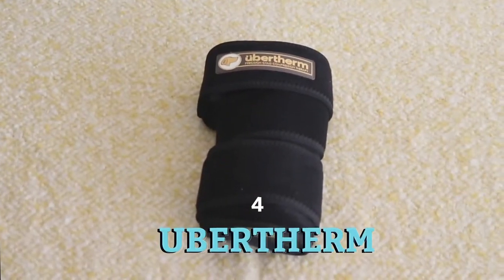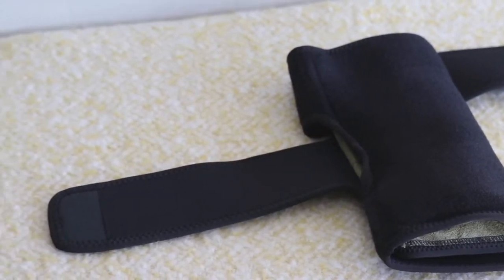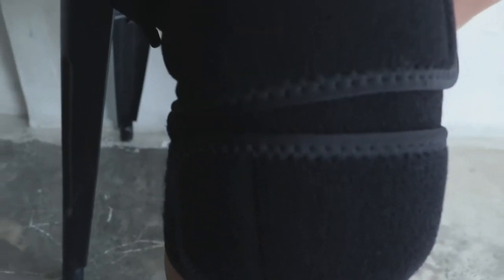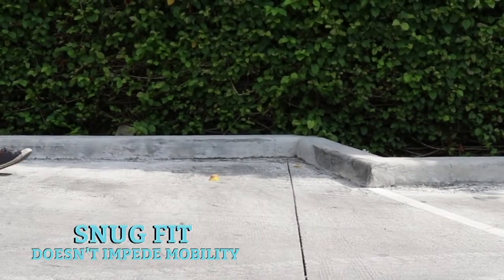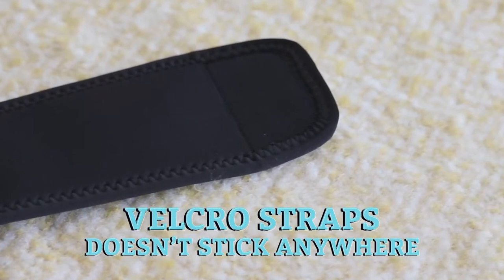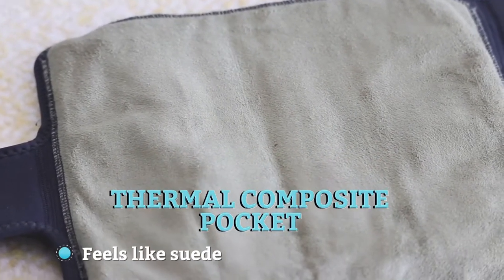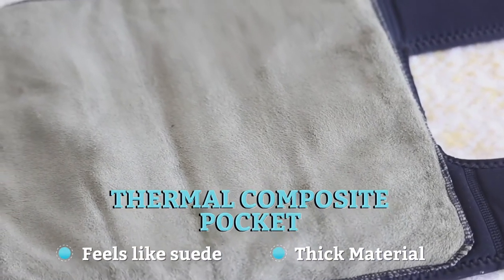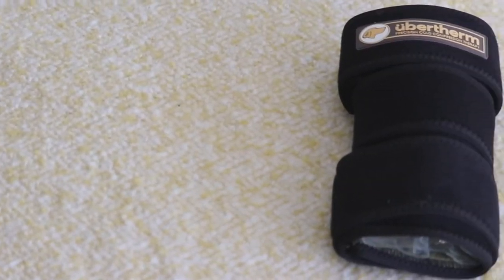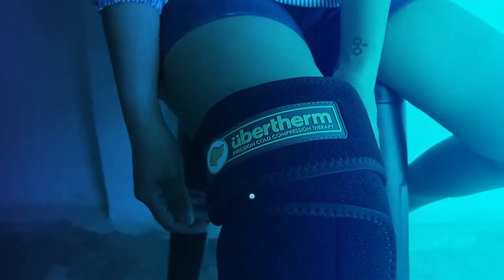Up next, we've got Ubertherm, one of the comfiest knee wraps we've tested. Instead of two straps, Ubertherm has three — two straps go one way and another goes the opposite direction. This design proved to be quite effective because Ubertherm has a snug fit that doesn't impede your mobility. One of the best parts of this knee wrap is its sleeve, called a thermal composite pocket — it feels like suede, nice and thick with a texture that feels soft and comfortable against your skin. This pocket is specifically designed so you don't need to wear clothes underneath, and it allows the cool temperature to sink into your skin slowly, preventing ice burns and skin damage.